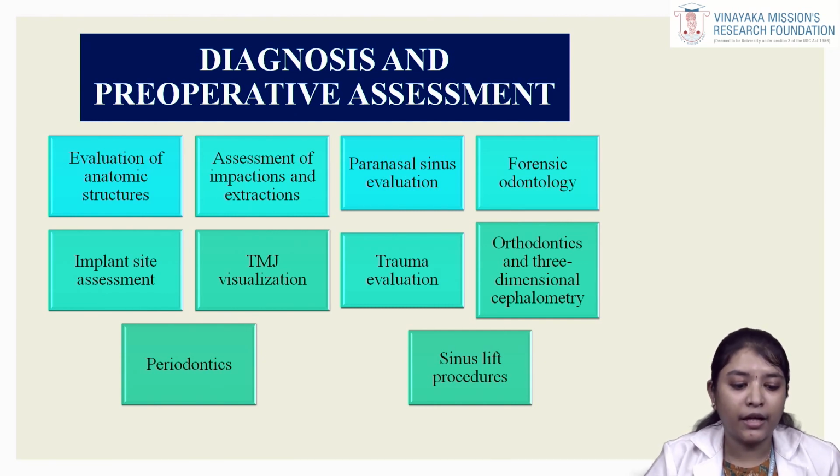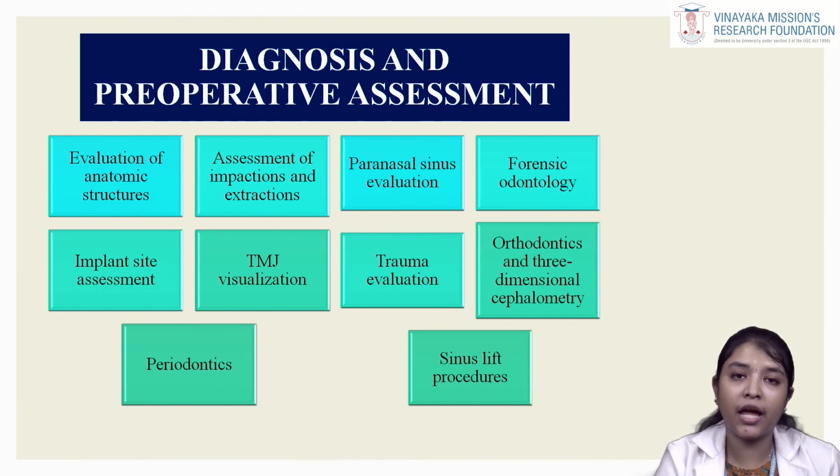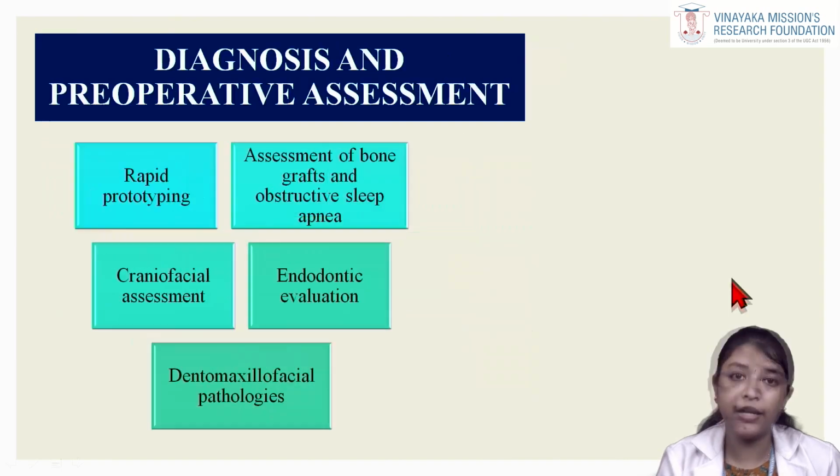As I said, evaluation of anatomical structures, assessment of impaction and extraction, paranasal sinus evaluation, forensic odontology, implant assessment, TMJ visualization, trauma, orthodontic purposes, periodontics, sinus lift procedures, rapid prototyping, assessment of bone grafts and obstructive sleep apnea, craniofacial assessment, endodontic evaluation, and dentomaxillofacial pathology.